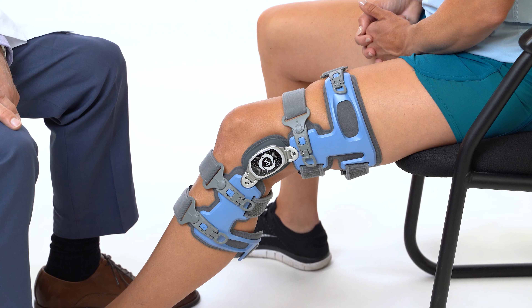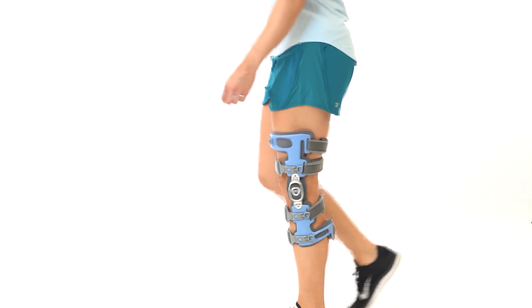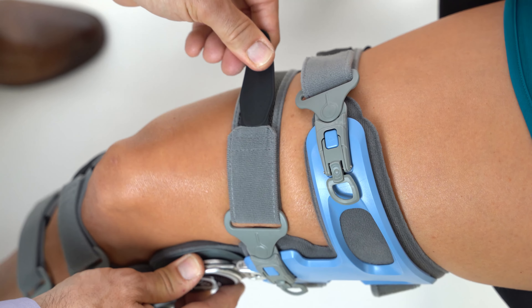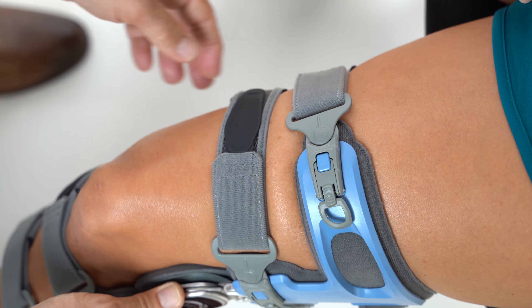Once the straps are secure, the center of the hinge should be aligned with the top of the kneecap and positioned slightly behind the midline of the leg. Walk a short distance to ensure proper fit — it is normal for the brace to drop or settle into position. Make strap and position adjustments as necessary. The straps are now set for proper fit and do not need readjustment for each application; the brace can be put on and taken off using just the buckles or push buttons.